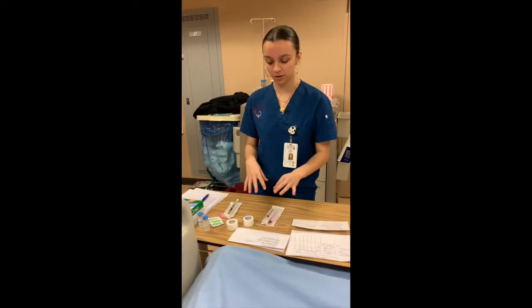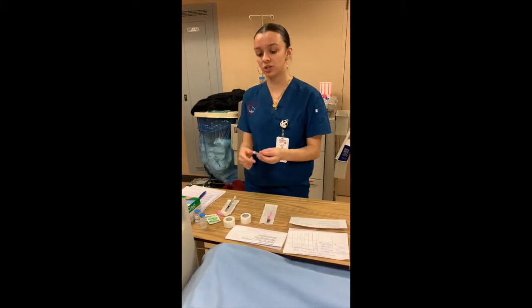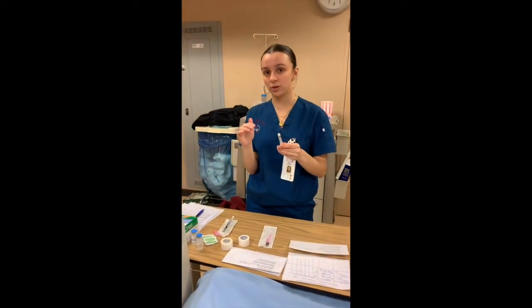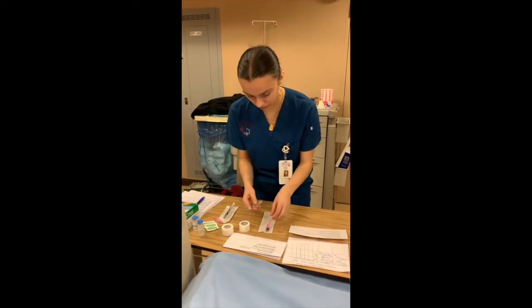First one I'm going to prepare is the intramuscular. So before you draw up the medication, you want to put 0.5 milliliters of air into the vial, just to release the pressure, and then we can prep it. So I'm just going to use 0.5 for this one.